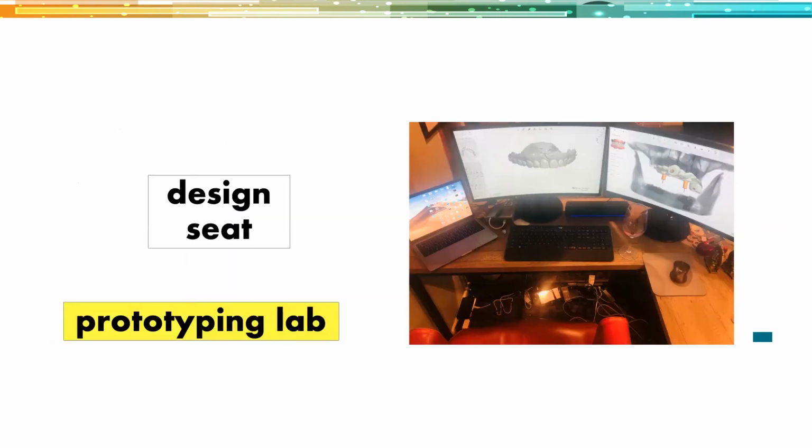And so today, I have a design seat, and that's where I'm sitting right now to deliver this presentation to you. What we consider the design seat is really a comfortable place to look at files and manipulate scans. There are 3 monitors here you can see. I have all of the CAD design software on my computer at work, which is always running. It's a gaming level desktop PC. So when I get home, I can just TeamViewer into that computer, and it's like I'm working in my office, except I'm home on time.